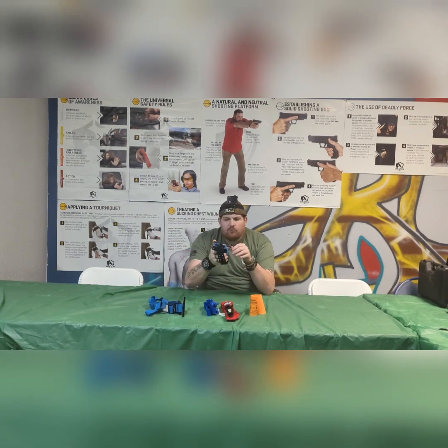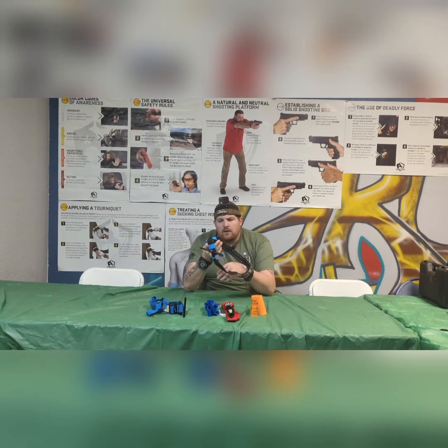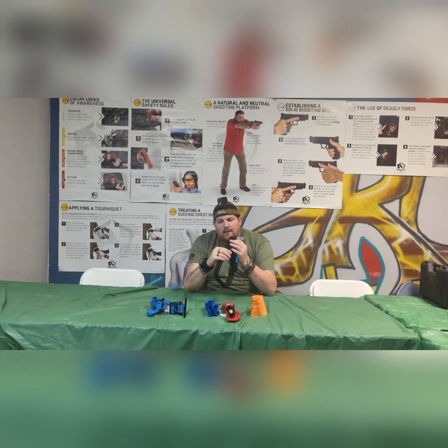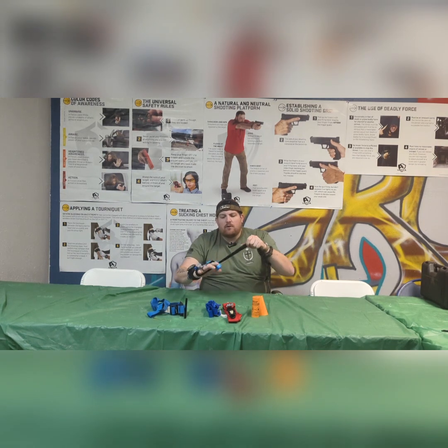The next one that I was exposed to was this one. This is a SAM XT, from the same company that makes SAM splints, the SAM Extremity Tourniquet, or XT. What I like to say is this is a CAT tourniquet on steroids. You're probably wondering, why are there holes in it? We'll talk about that here. It applies the exact same way, except with these holes, once you get it tight enough, and I'll just go around my hand here.